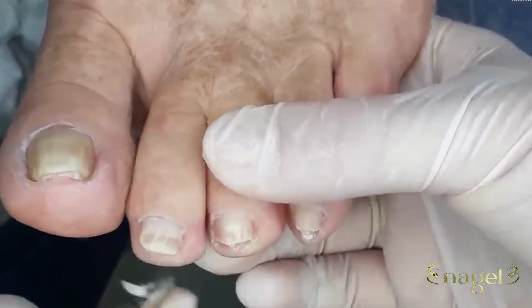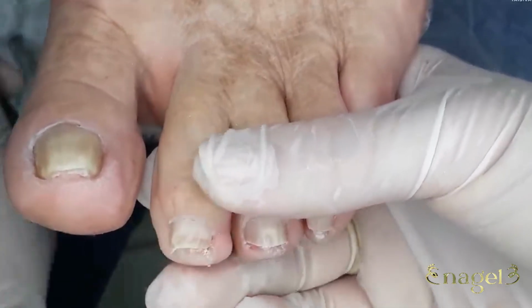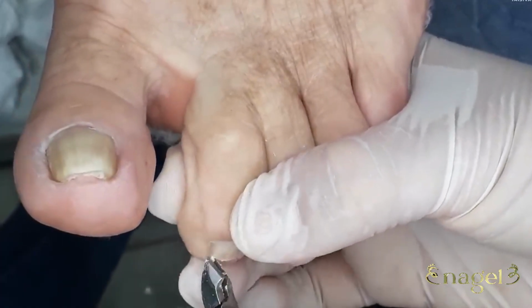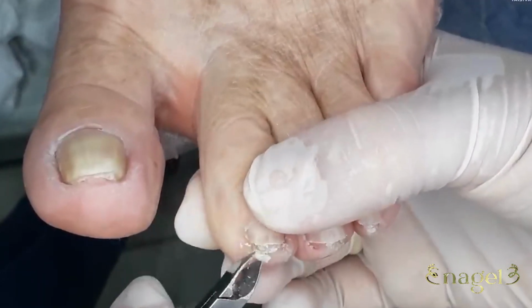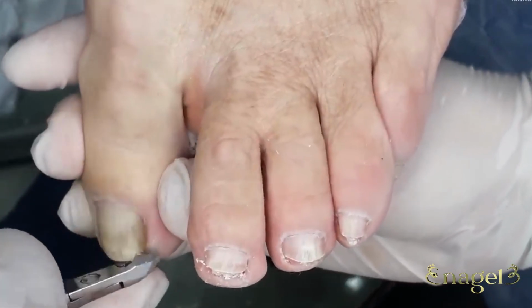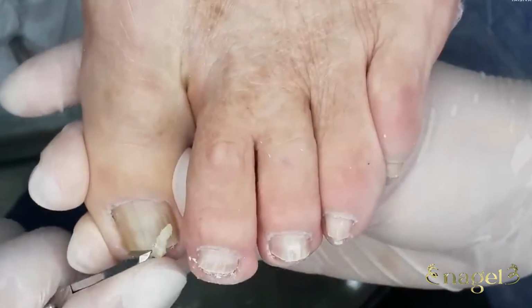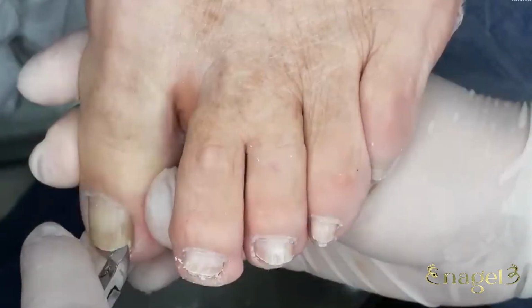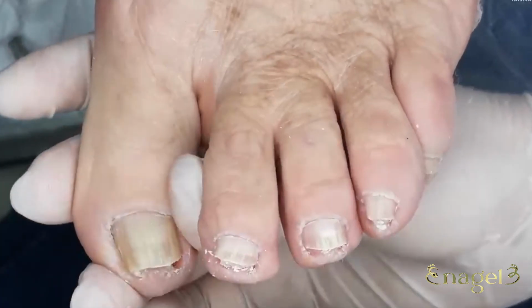I use a specific file for fungal nails, which allows me to gently wear down the damaged layers without harming the healthy nail underneath. This process is slow and requires care, because I don't want to remove too much and weaken the nail. As I file, I notice the nail is quite thick, as my mom described, and this is typical of fungi that build up over time. She even joked that it feels like wood, and indeed the texture is very hard. This thickening occurs because the fungus alters the nail's keratin, making it brittle and opaque.